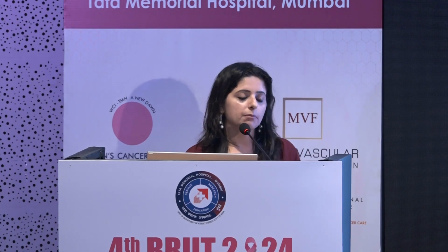Out of the 45 patients, they lie in the range of BI-RADS 4 and 5. 51 lesions were evaluated, of which 41 were seen to be malignant and 10 benign in nature. The CAD evaluations were not very significant; they detected 39 malignant tumors and 10 benign tumors, and the rest were picked up by the visual readers, and the detection rate was 96%. The tumor size and the morphological differences were not changing with either contrast agent.